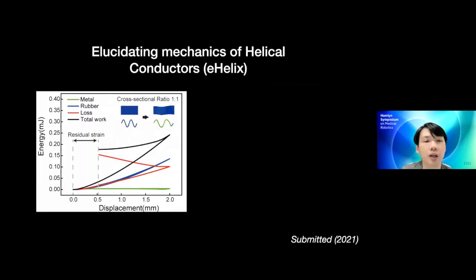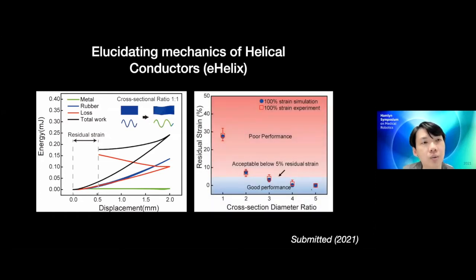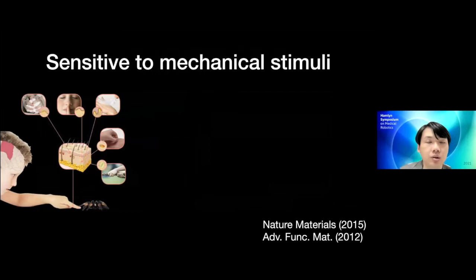But the mechanics of it is quite interesting, and we actually started looking at this as well, and we found that you need an appropriate volume of the elastomer to the metal wires in order to have this ability to restore itself. If you have a low volume of elastic material to the metal, you actually do not recover, what we call the residual strain. So when you stretch the material, some of the energy gets dissipated, and when the elastic material does not have enough energy to bring the metals back, they have a residual strain. And so we found that having a ratio of roughly 5 or so to the diameter of the metal wires gives you a pretty good residual strain of less than 5%, which is mostly negligible. Well, this paper is still under review, but hopefully it'll come out soon, where you can read up more on the details of the mechanics of such systems, such hybrid hard, stiff metal and soft elastomer systems.